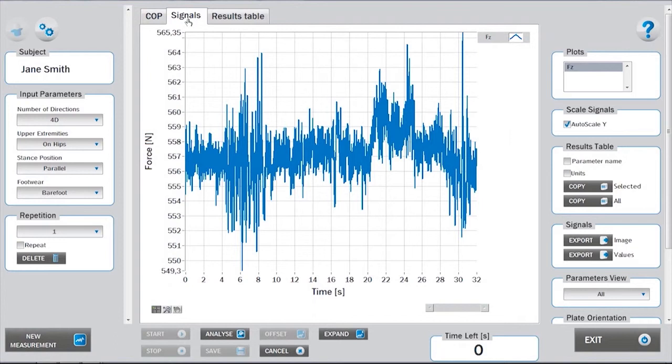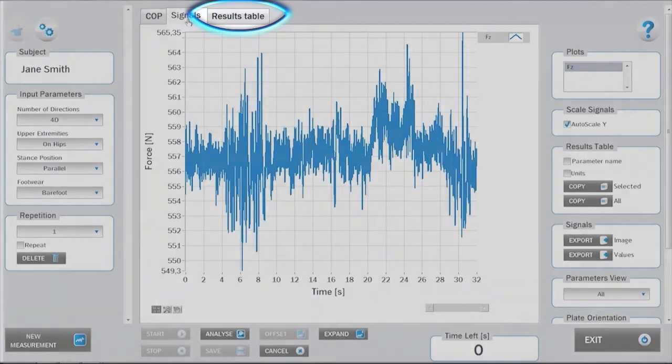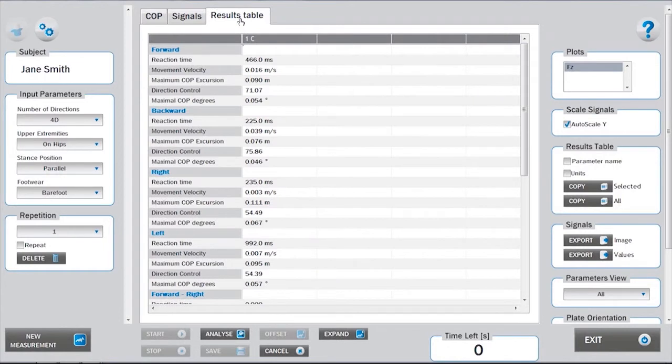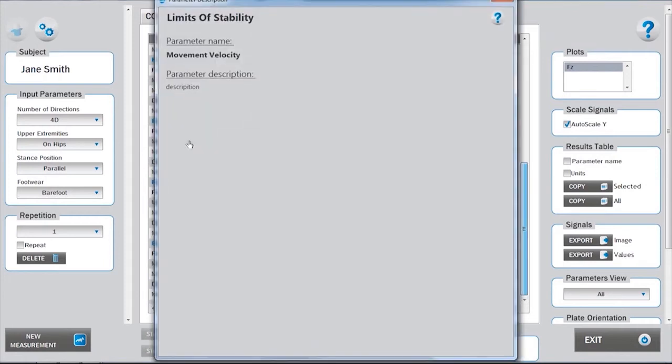The data from the analysis can be viewed under the Results table tab. The results parameters are divided into different groups separated by blue headings. A more thorough description of the parameters can be accessed by right-clicking on the parameter name.